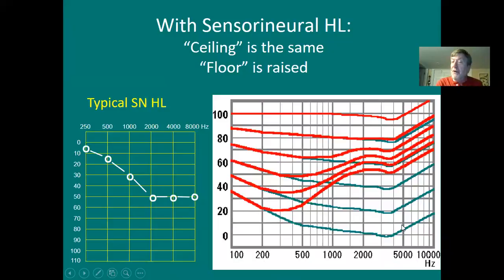All audiometers take this bottom line and they flatten it, and they call it 0 dB HL, right? All those differences across this bottom blue line are built into, calibrated into the audiometer. That's why you need them calibrated every year. Anyway, regardless, the guy with hearing loss, we're looking at the red lines.